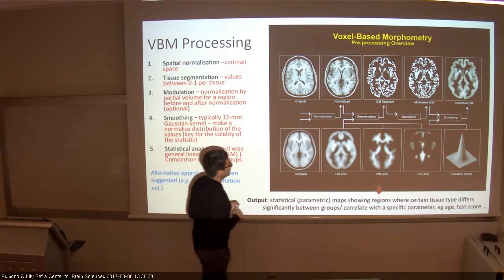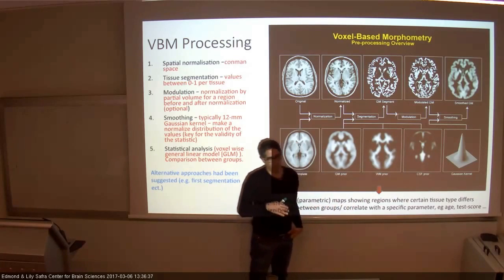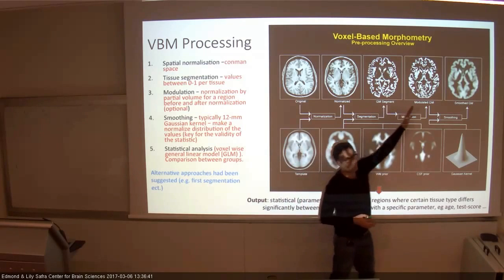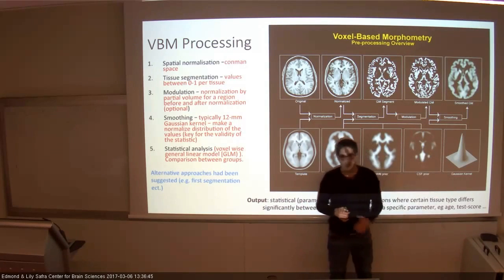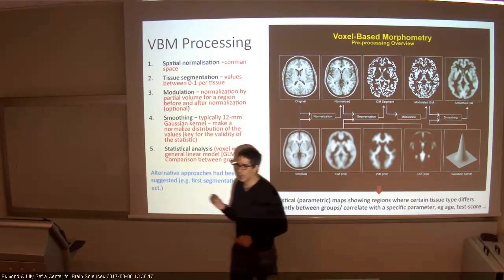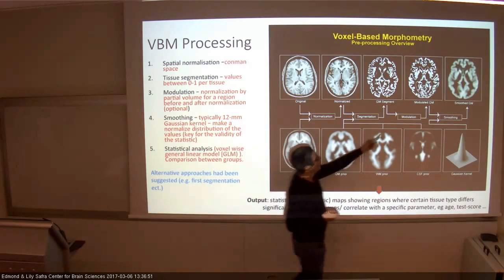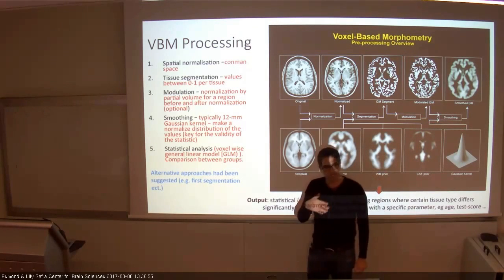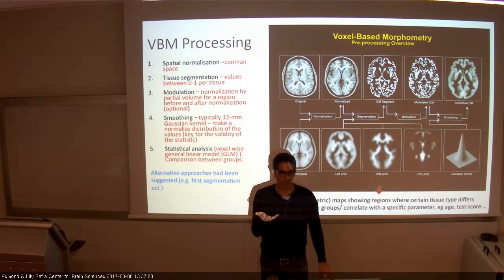And then the next step is they have some parameters. Where is gray matter? Where is white matter? Where is CSF? There is also the intensity of the image. Using both, they segment, okay, and they smooth. So now we have a gray matter. We have the position could be gray matter, and after smoothing also could be like not exactly gray. So we have like different levels of grayness, okay, of a position.